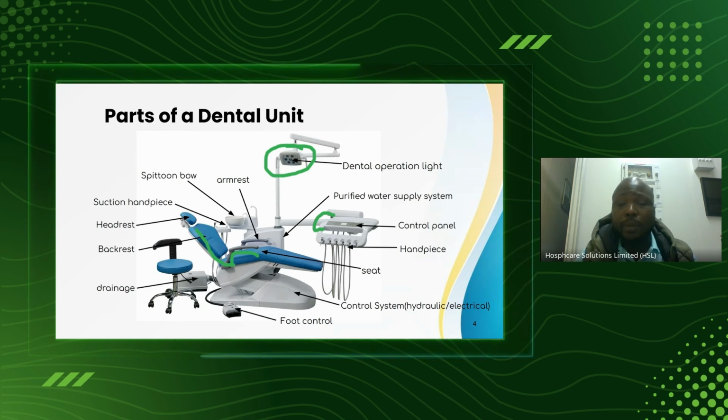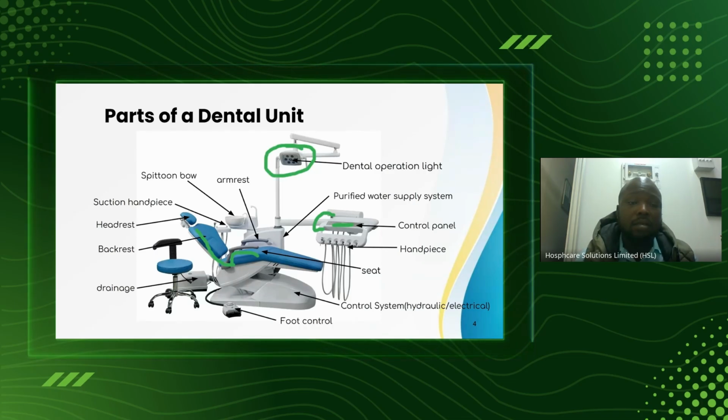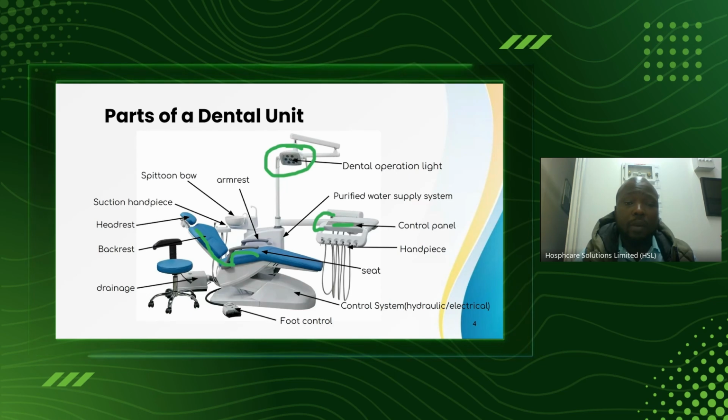In the middle, we have the handpieces cords. You have 2 high-speed handpieces and 1 slow-speed handpiece. And at the far end, we have the scaler handpiece. We also have a control here. This is a control panel. This enables or deactivates the movement of various functionalities of the dental unit. It can also activate some functions of the lights and more.